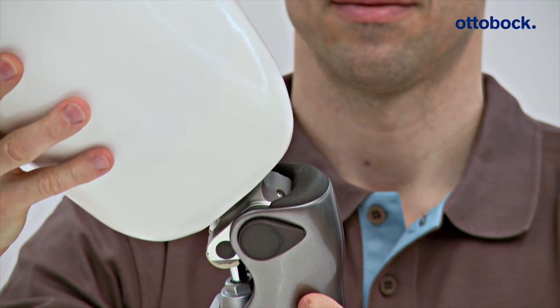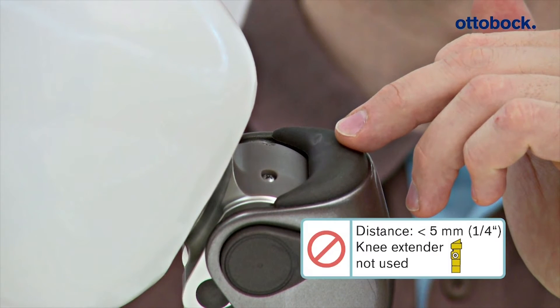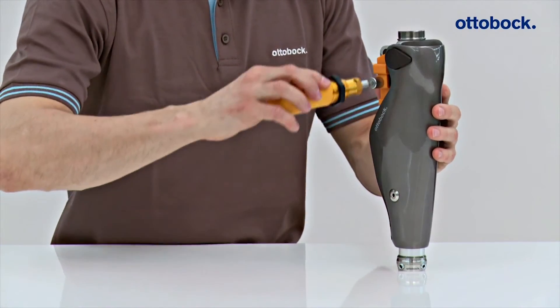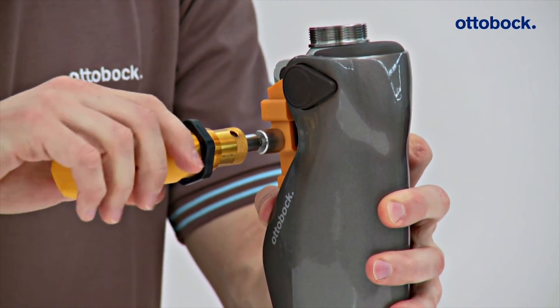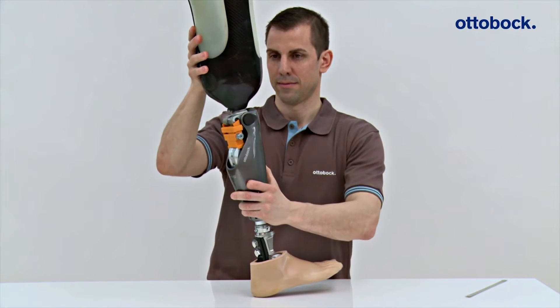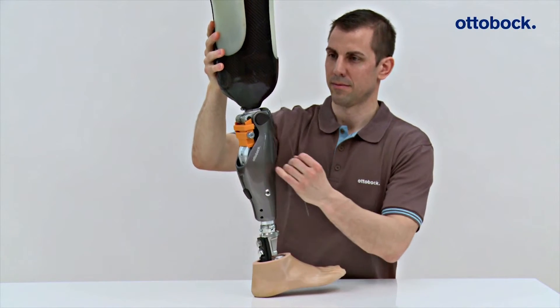If, as in this case, the specified minimum distance is not maintained, readjustment of the distal socket area is required at a minimum. The knee extender must be applied during bench alignment of the C-Leg 4 to simulate a loaded prosthesis. There must be at least five millimeters of space between the socket and main electronics even when the knee extender is applied.